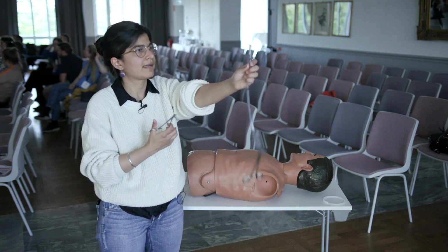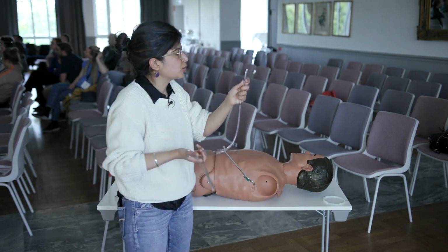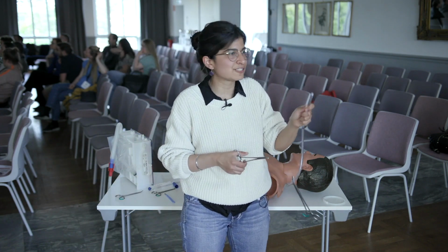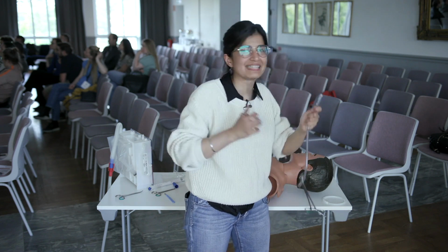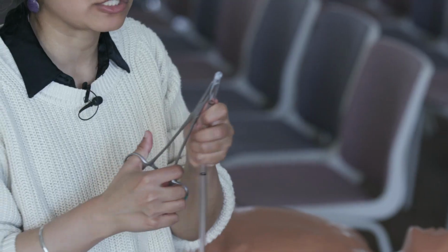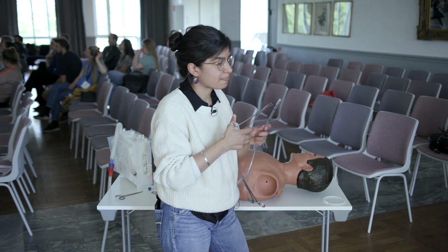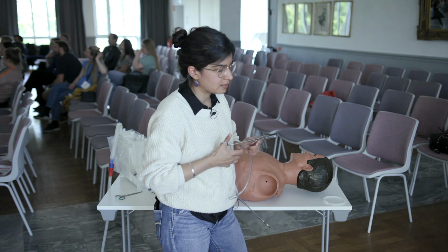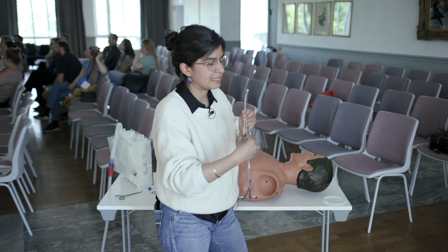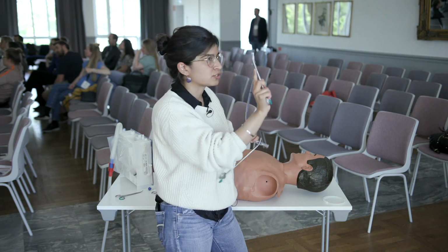It may just be this particular drain. So if you have something that looks like this, don't clamp at the end, okay? You can just go through the fenestration and clamp here. The only thing that matters is you grab a curved Kelly and clamp it in a way that maintains the curve of your wrist, right? So you clamp it like this.